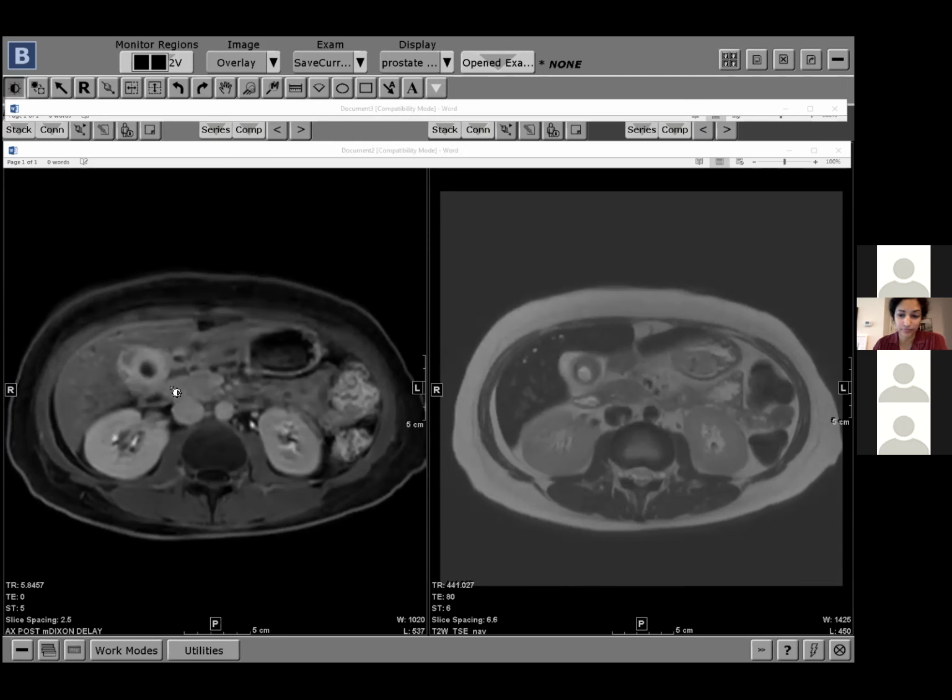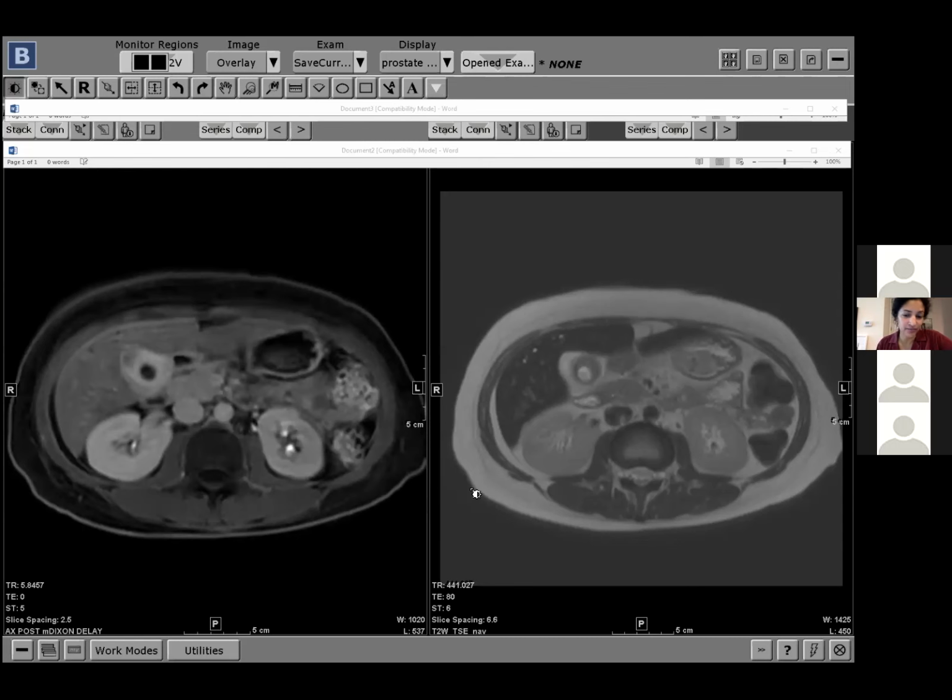Artie, do you have any suggestions for my differential? Well, since you're showing it here, I was thinking of IgG4 and xanthogranulomatous cholecystitis. Xanthogranulomatous cholecystitis usually has cystic spaces, but I guess if you're talking about a diffusely infiltrative, inflammatory-looking process. Right. So this is exactly what it was.